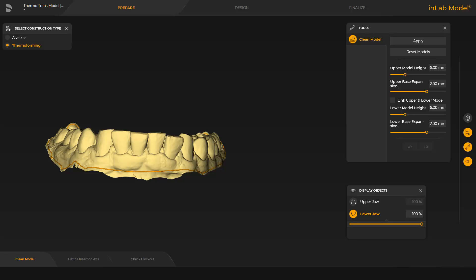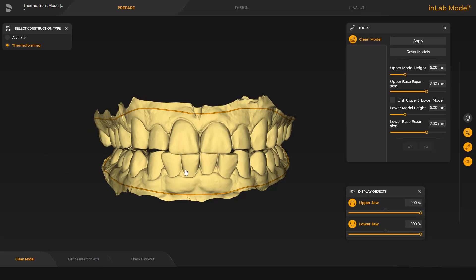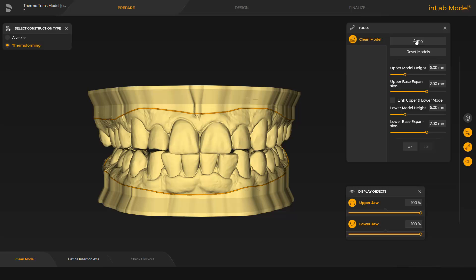Here we also skip over the rest of the cleaning for both the lower and upper jaw models. Additionally, after cleaning, in the window under Tools, different parameters can be determined in regards to the model base height and expansion. As soon as Apply is tapped, the base will be calculated. Since the splint is made for the upper jaw, we will limit our focus to the upper jaw for the remainder of the tutorial.